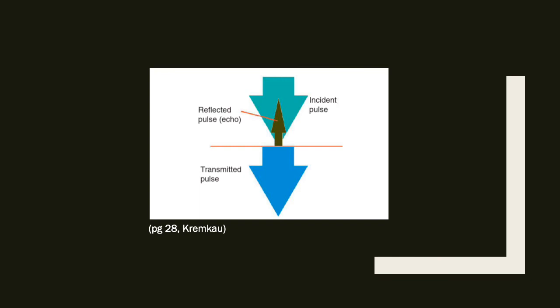Now, we are really starting to put together some of the fundamental concepts of ultrasound. The next thing that we need to try and talk about and understand is how on earth do we actually get an image? Well, we've already talked about how diagnostic ultrasound is pulsed ultrasound and how each image is made up of multiple scan lines. When a pulse of sound is sent into the body, that sound is actually going to encounter multiple interfaces. So once it hits an interface, it can either get reflected back to the transducer, it can get scattered in a different direction, or it can continue throughout the body.